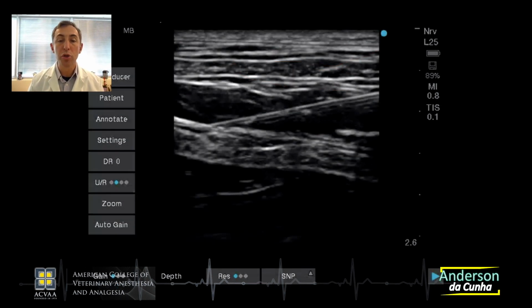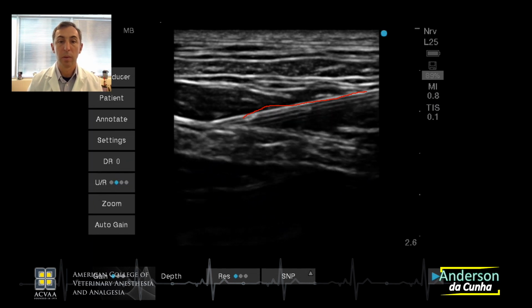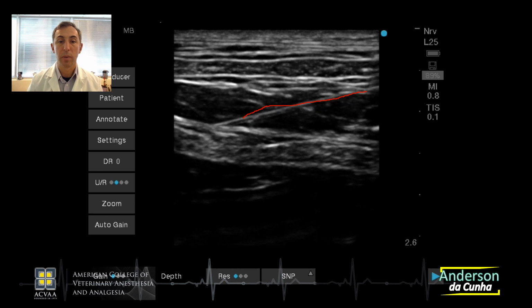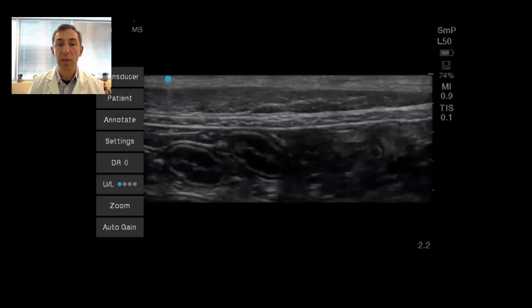This next slide will show you an unsuccessful injection. So this needle, as you can see here, this is the shadow of the needle, right? And this injection will be performed at an area that's not in between those two fascias that we were looking for. So what's going to happen, since this is an intramuscular injection, you will see this explosion during the first injection. So let's play the video. That is an indication that your needle was not in the right plane. So let's watch this again one more time.